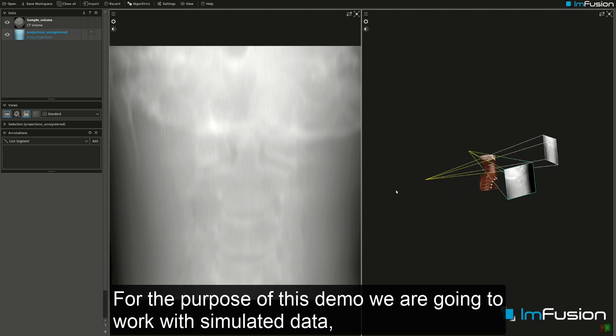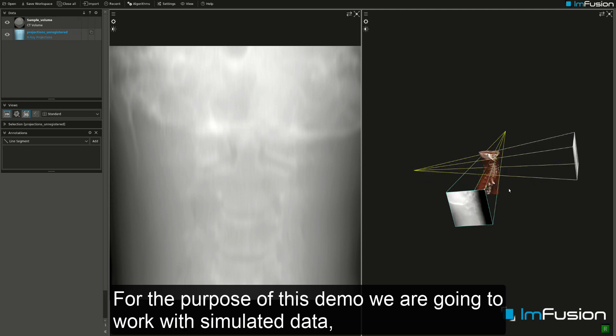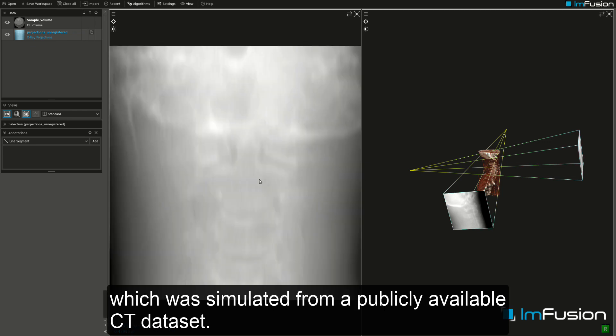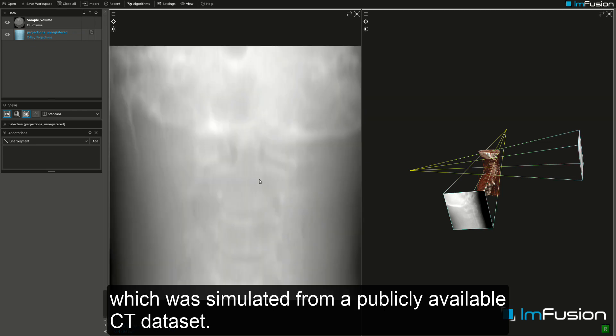For the purpose of this demo we are going to work with simulated data, which was simulated from a publicly available CT dataset.